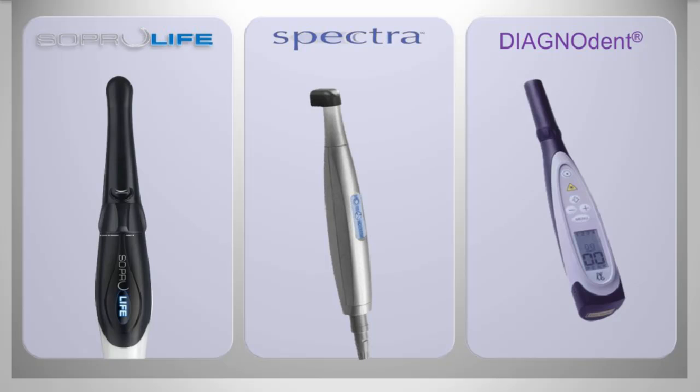It's too much to go into in the short amount of time we have tonight, but just to give you an idea, there's a system called the Canary system by Quantum Dental Technologies. You might want to look at that. You want to look at Caries ID. Many of you might know about that. I think that's been out a while, by Midwest, that uses LED technology to detect decay.